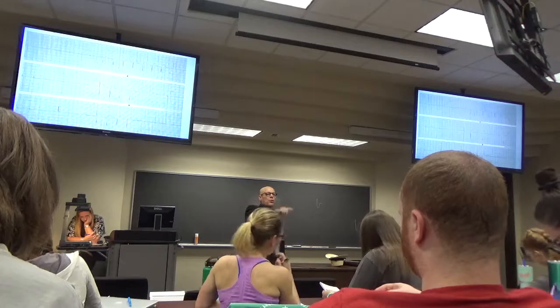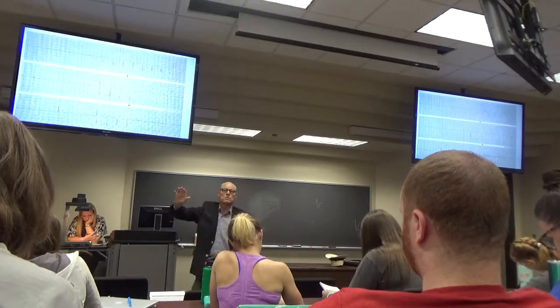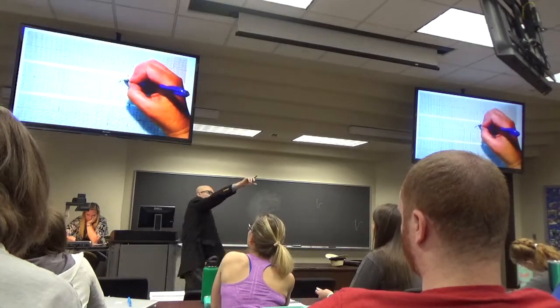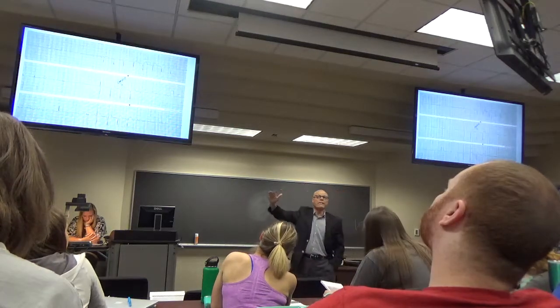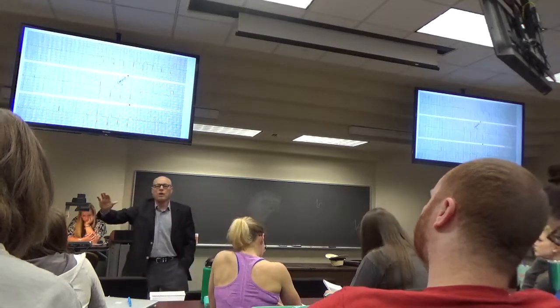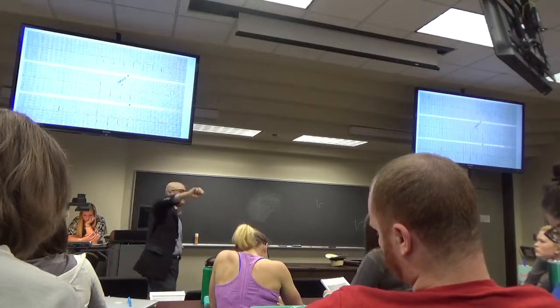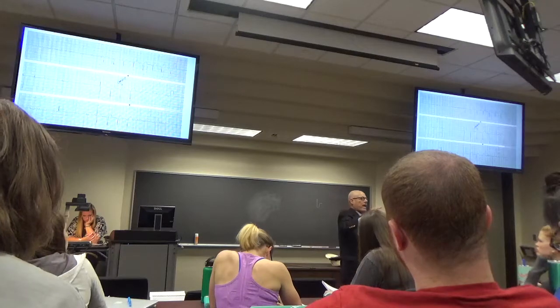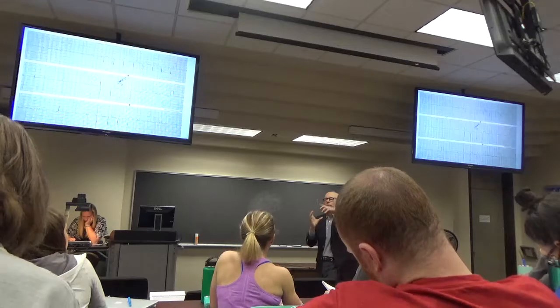If you've already got a Q wave, the infarct's been there for a while, at least hours. And so if you've got this elevated ST segment with upright T wave, in the presence of a Q wave, that's not an acute infarct. That's an old infarct. And since that ST segment is elevated so perfectly there, it's most likely representative of a left ventricular aneurysm where the infarct is. Does everyone understand what I mean by aneurysm?